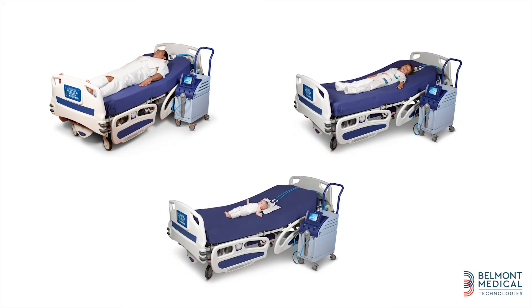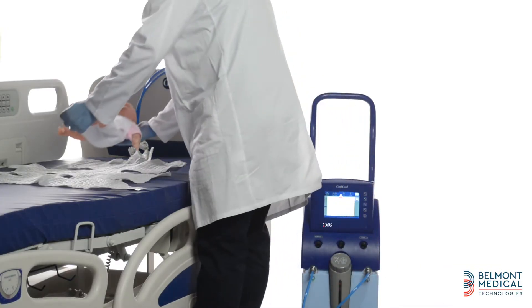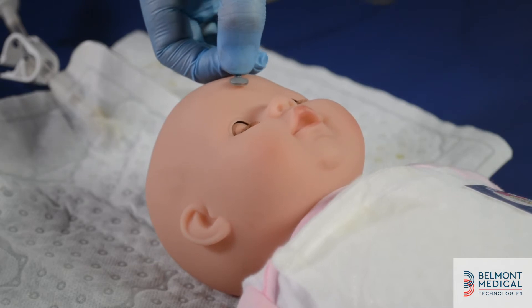Choose the appropriate cure wrap for your patient. We provide adult, pediatric, and infant cure wraps in different sizes, which give full body coverage. Open the wrap on the bed and position the patient as shown.